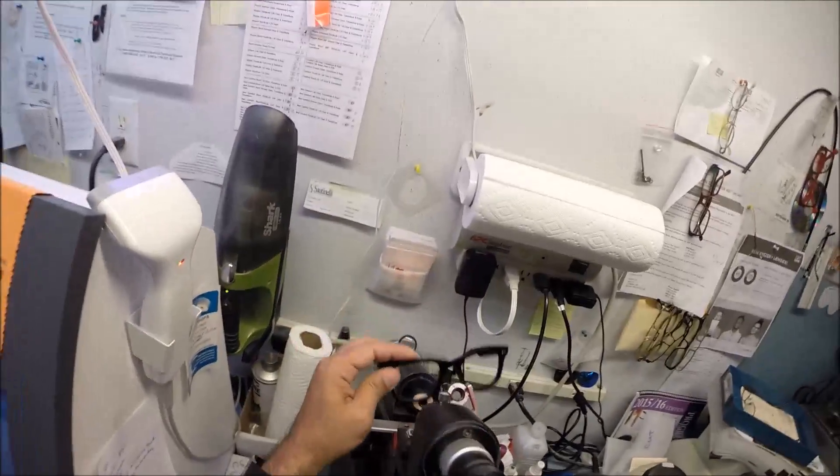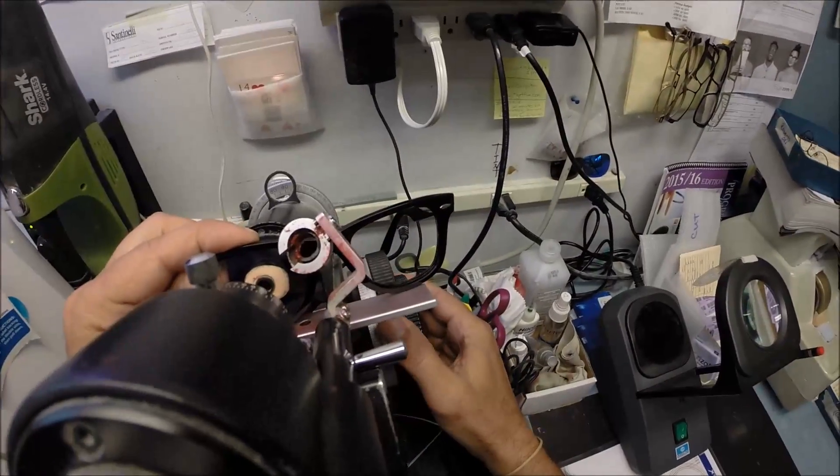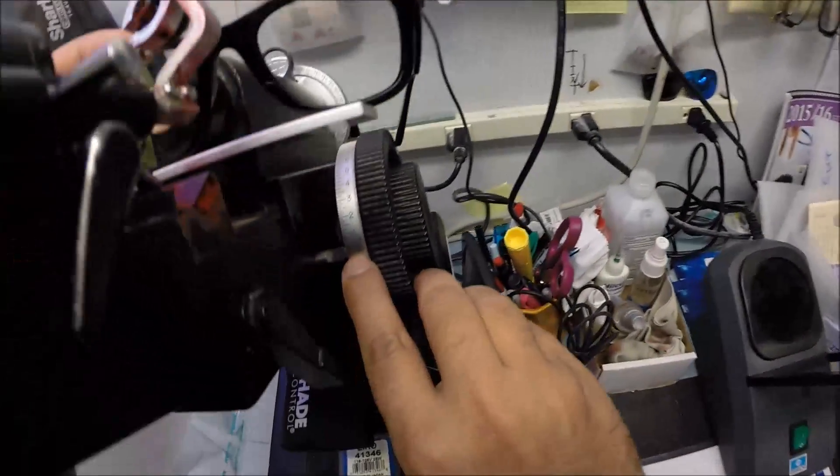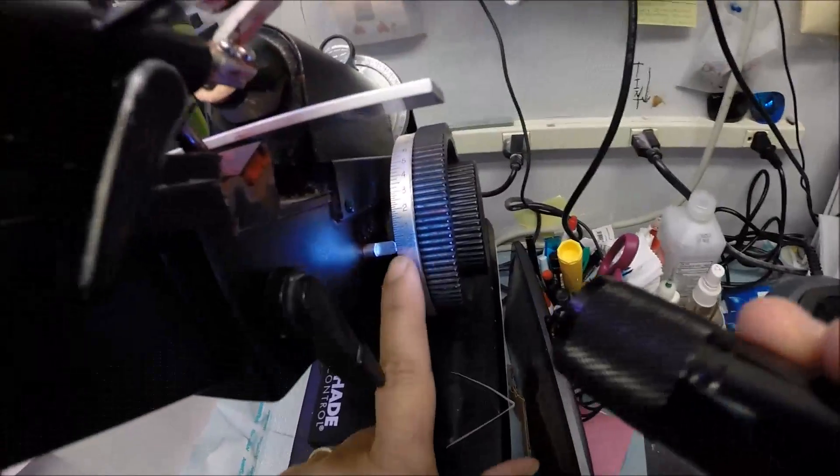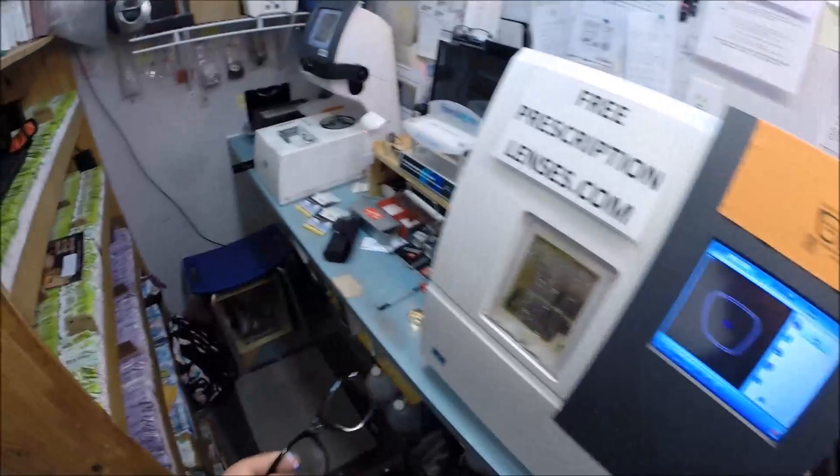If these were prescription I would come down here and verify that these are made right but I'm coming up with zero. That's zero power which is no prescription whatsoever.